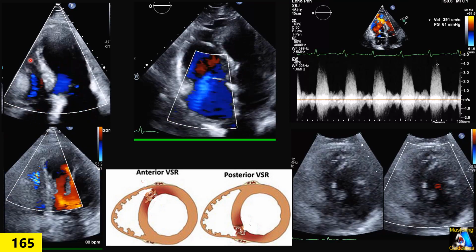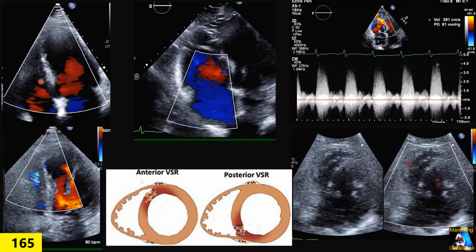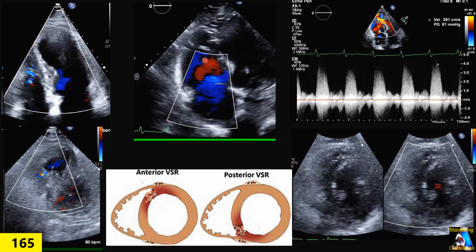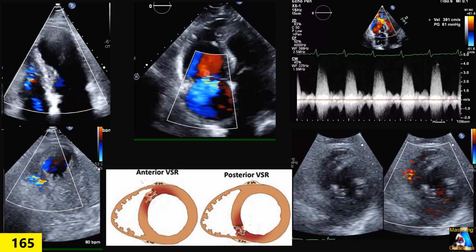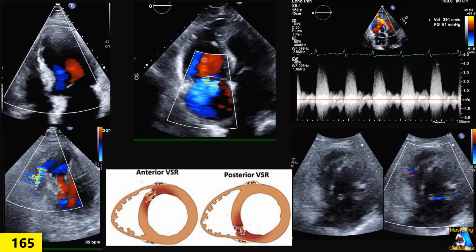First, we have some intracardiac obstruction that gives us a high gradient and turbulence, like this one or this one. Or second, we have a shunt. In each case, you have to go and find where is the source and what is the cause of that turbulence or jet.